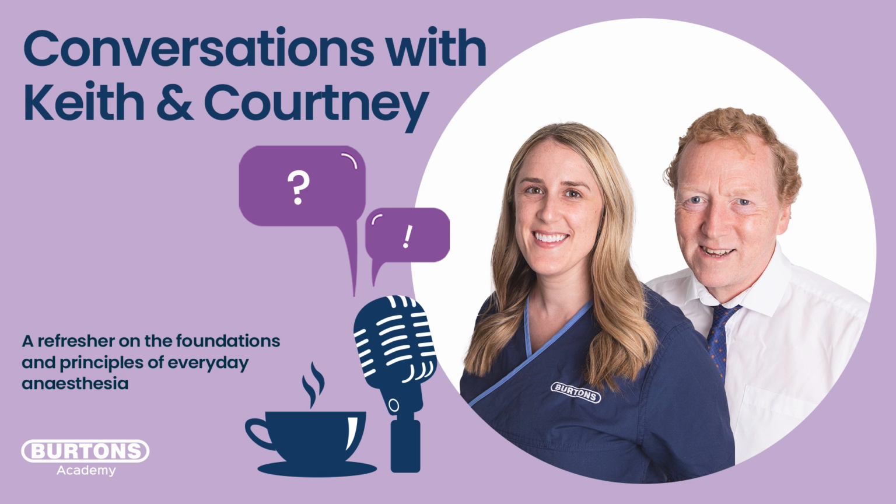At that point, the oxygen reserve in the lung has all been used up, so you're in a state of hypoxia already, where you've been heading towards it. So you won't see it for a long time, and by the time you see it, whatever event happened was quite a while ago, because it's used up all that reserve before you see the effect.